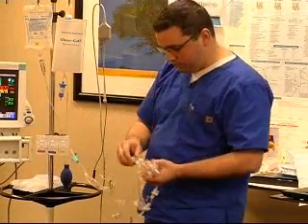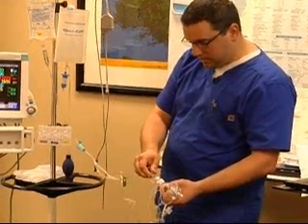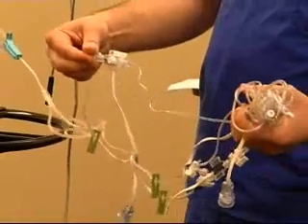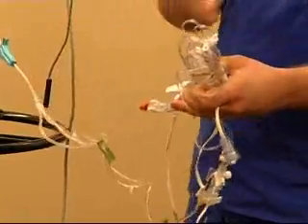So as you go through and you're priming this system, you can see that, I'm making a mess on the floor, but you can see that once you get all of your air out of the line there, you just turn the stopcock, and then it's going to continue on to the next step. And it's kind of a good thing to remember if you just go systematically through here, because there's a couple things.